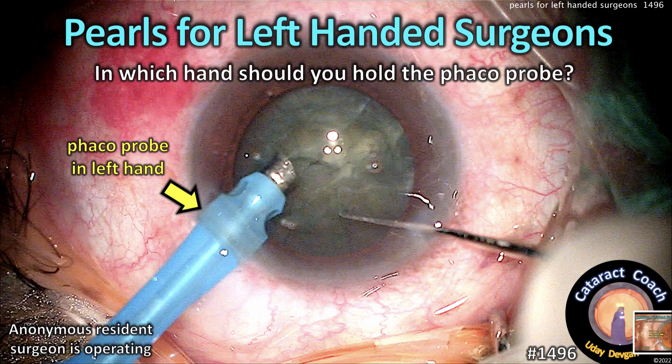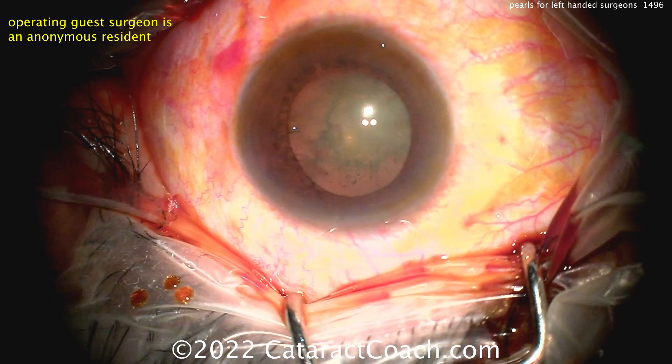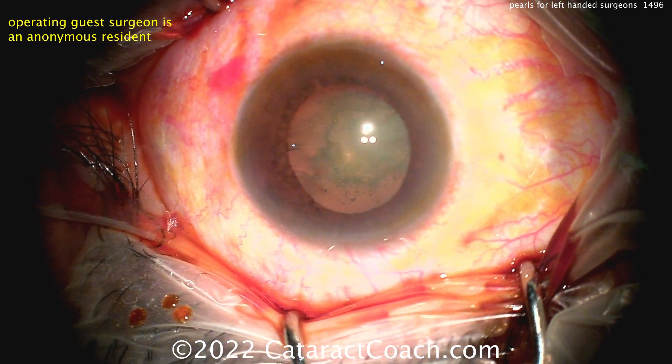CataractCoach.com — pearls for left-handed surgeons. In which hand should you hold the FACO probe? I'm here to tell you, it doesn't really matter. But there are some things to consider.